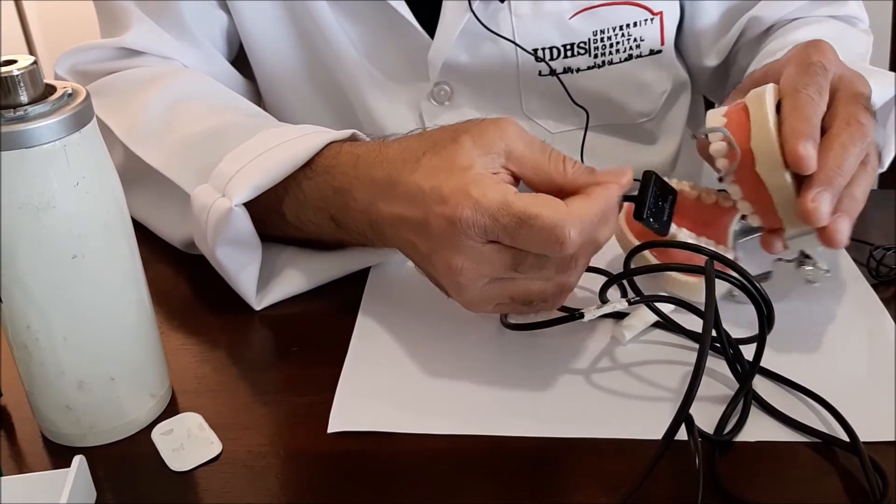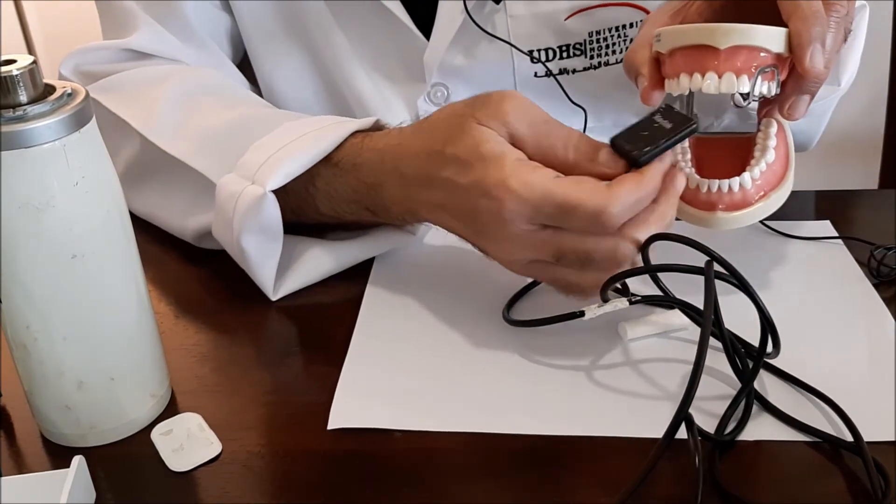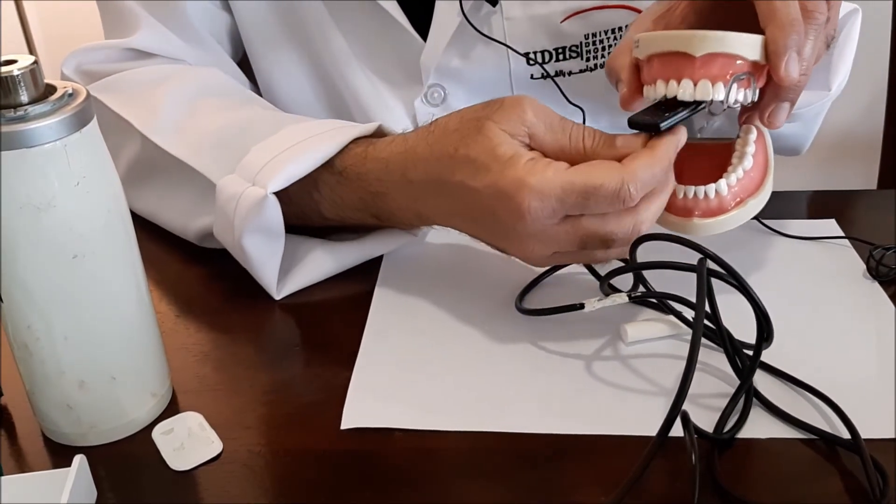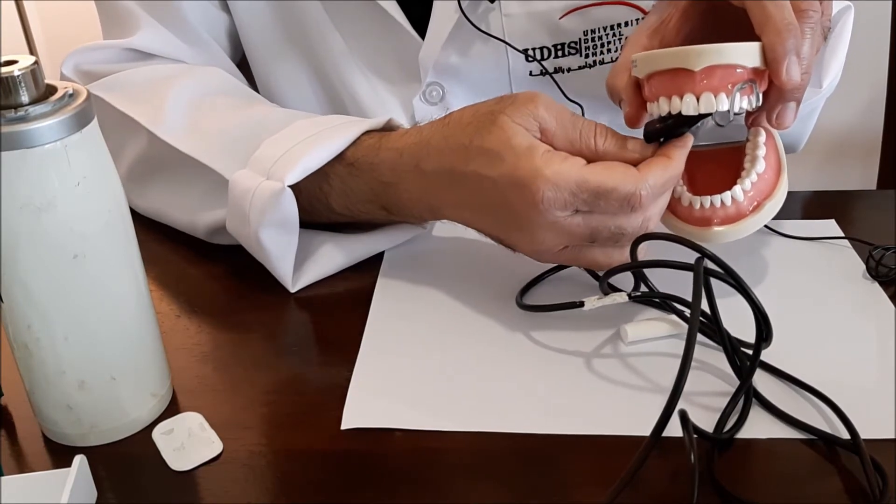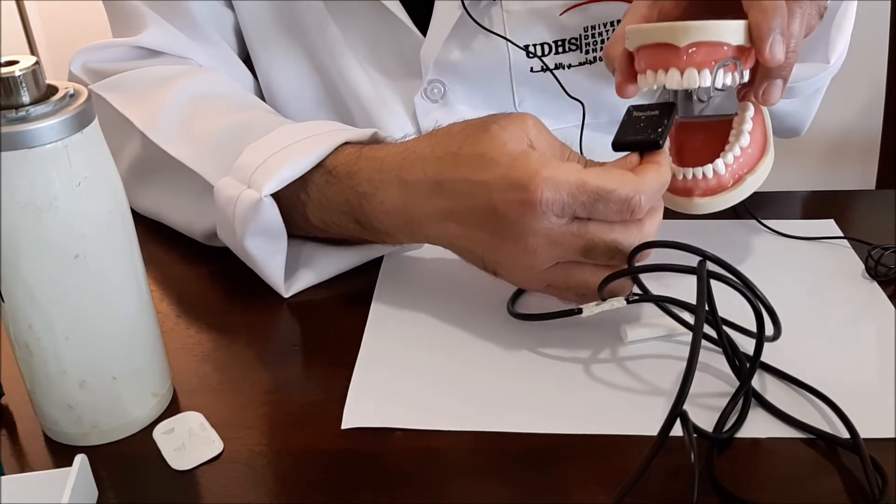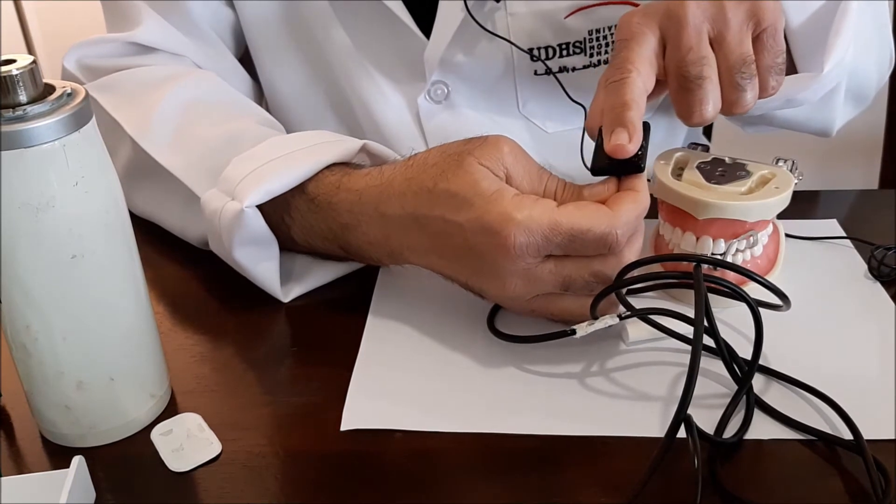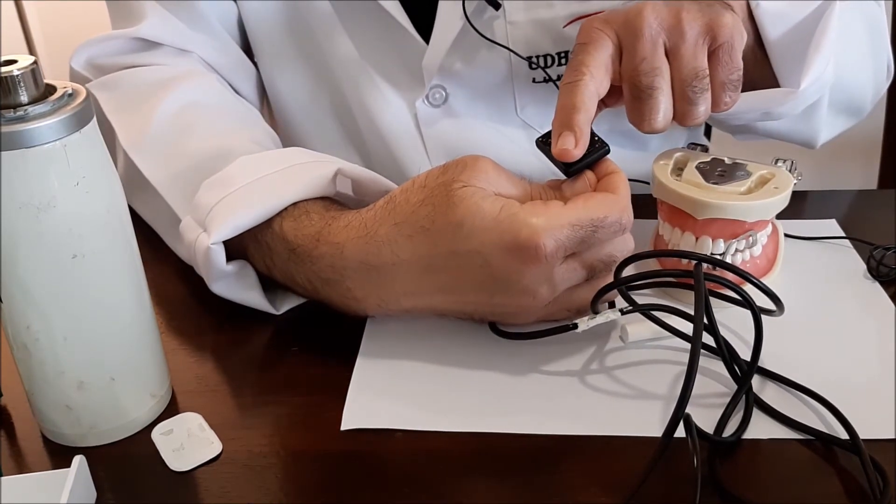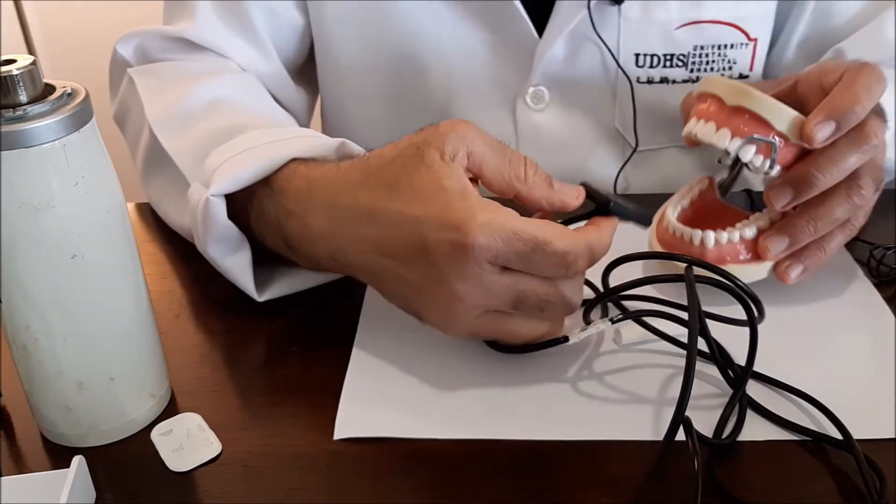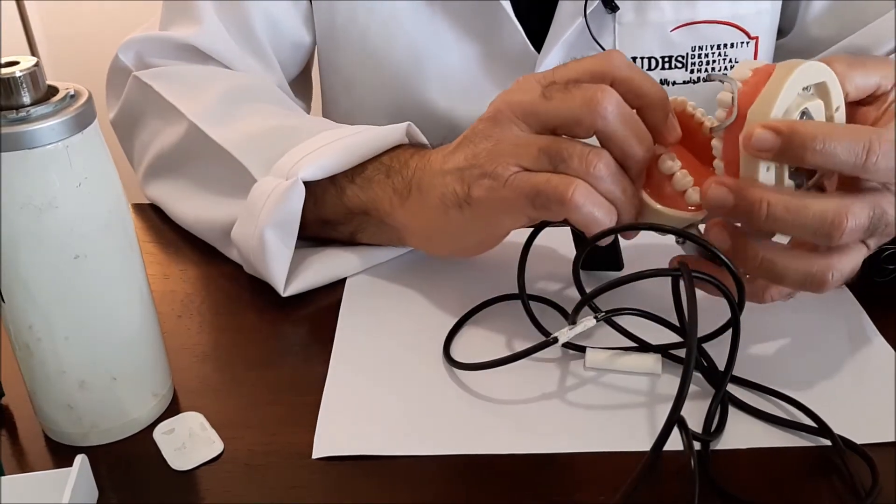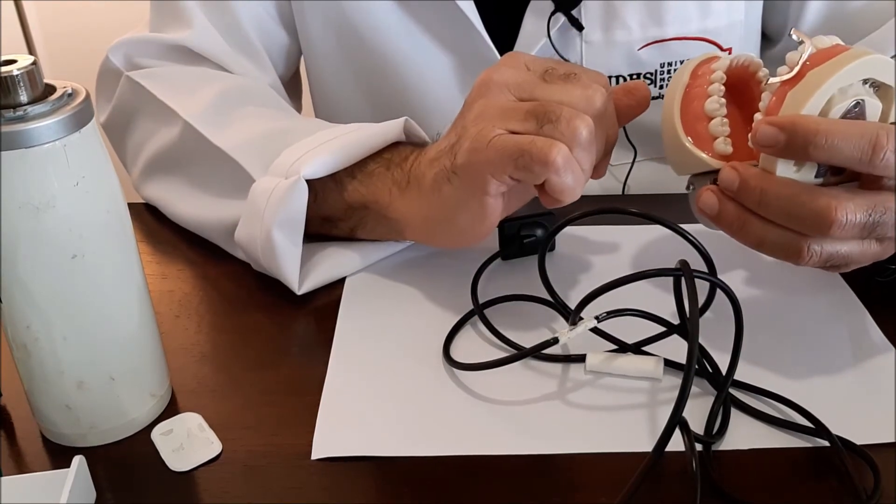This is a maneuver. Let me do it on here without the clamp. See, you just tilt it this way, either way, this way or this way, so that the canine instead of being here, it will be placed this way so that it will include the full length of the crown. This is a special technique that you would use for the canine itself.